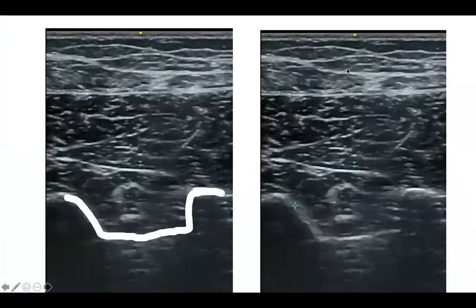As I said, this is the lateral gastro, medial gastro, but you can see tibia, fibular. So I increased the depth, so I was able to see, once again, adipose tissues, medial gastro, almost in the middle of the leg, lateral gastro. Because the gastroc is so small, I know this is after the middle point of the distal leg, and underneath is soleus.